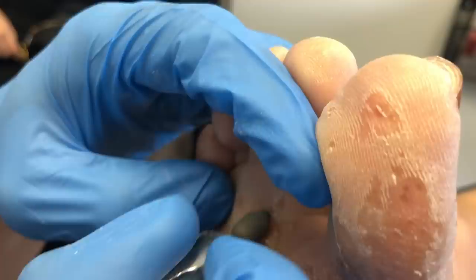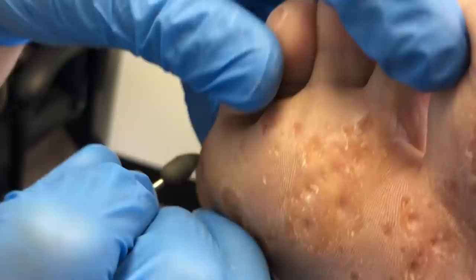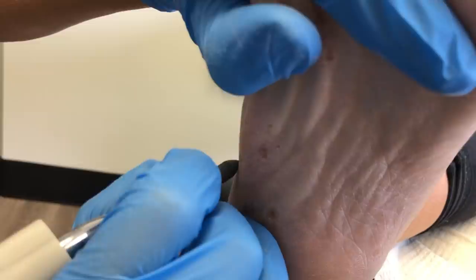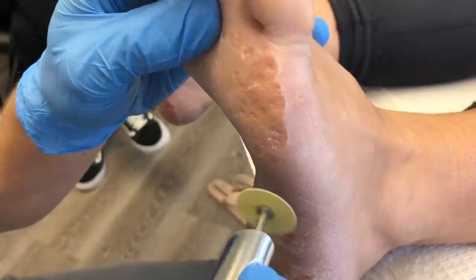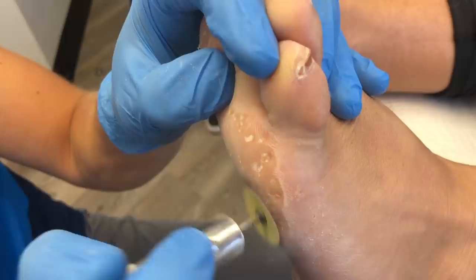Once we're done with the burr — you can see how deep some of these corns are when the burr goes in — I'll switch to the Moore's disc for finer detail. In this video you'll actually see the Moore's disc completely split; they rotate so fast that eventually the paper just blows right through and you have to switch to a new one. I also went through four blades total — two 10 blades and two 15 blades. Dull blades make the work harder and are more dangerous because they catch more, so I switch blades commonly throughout the treatment. Now switching to the Moore's disc — the bigger surface really cleans things up and makes the skin nice and smooth.